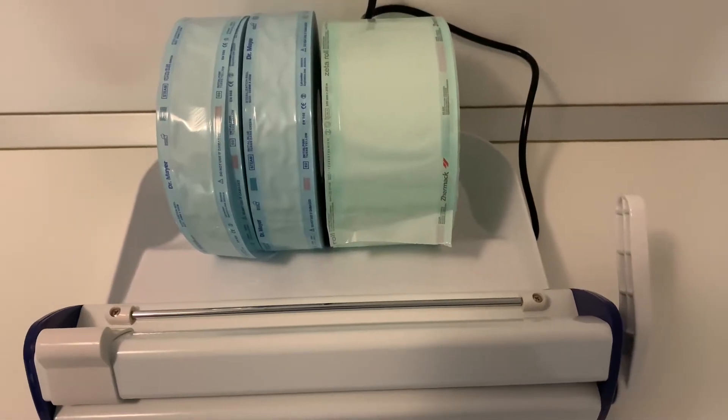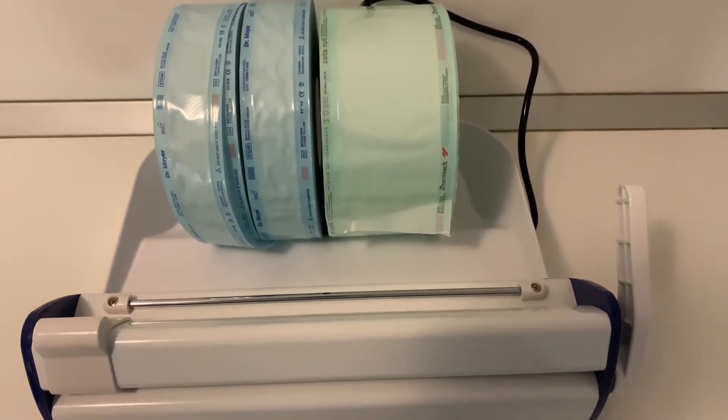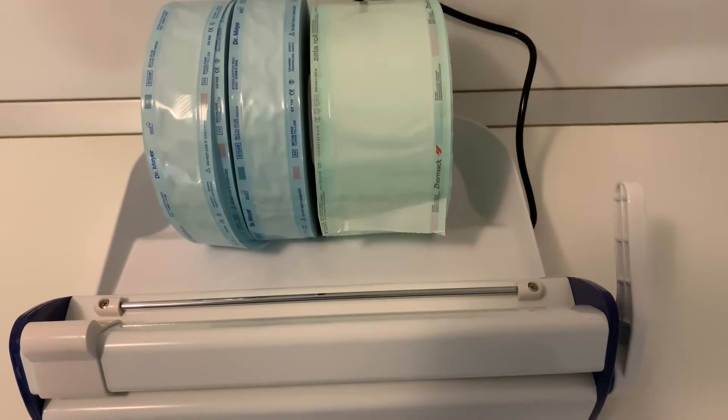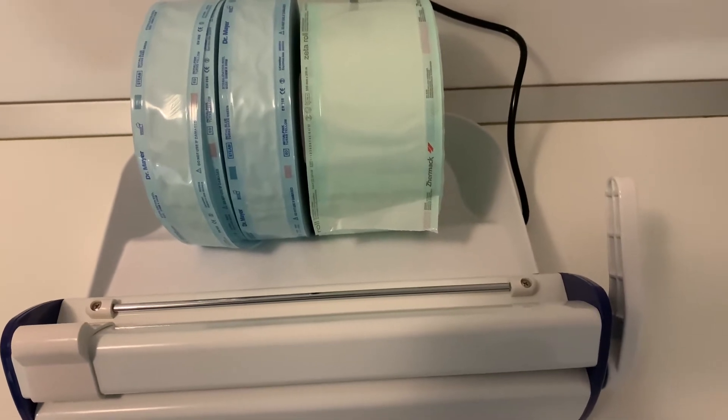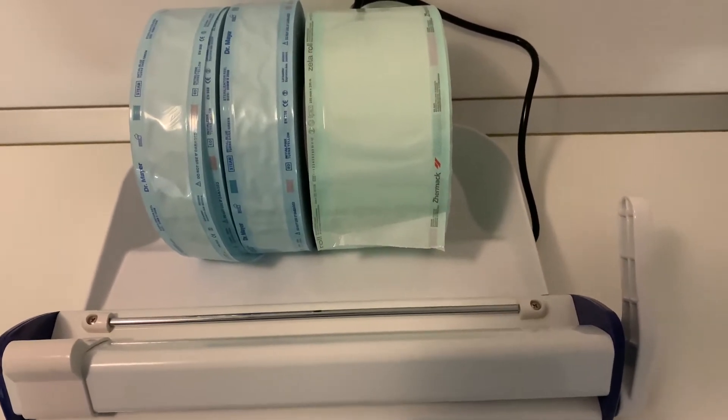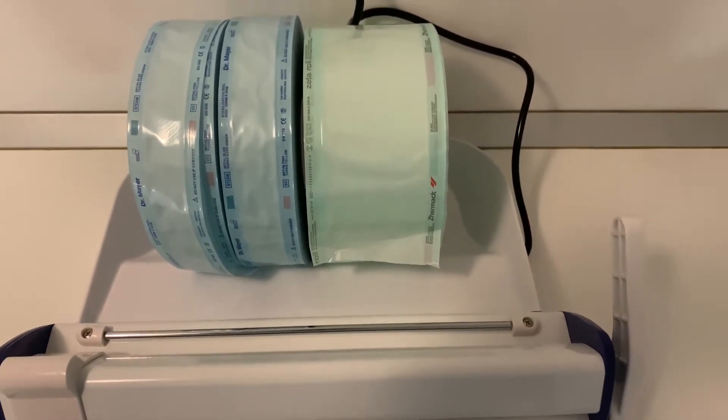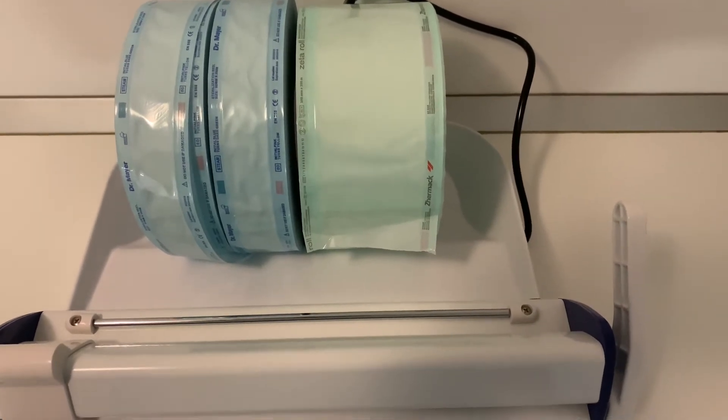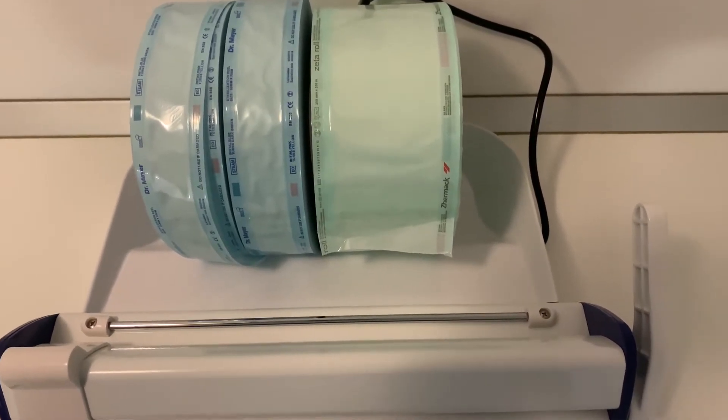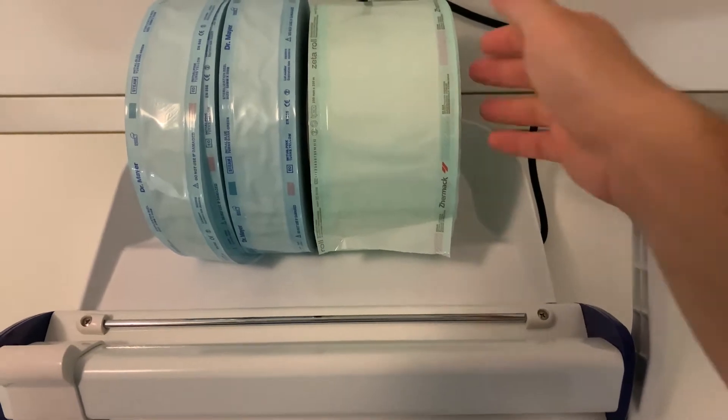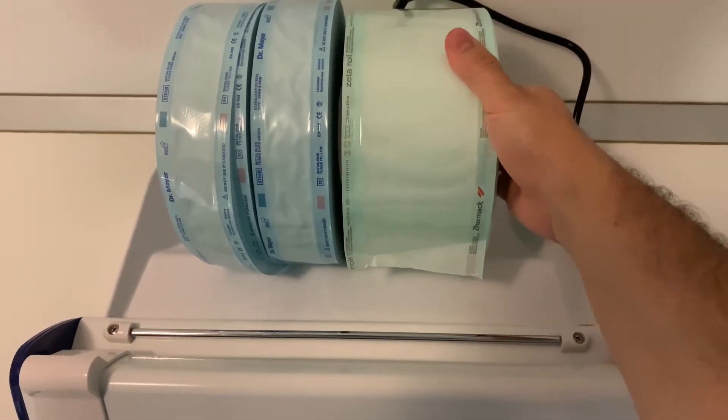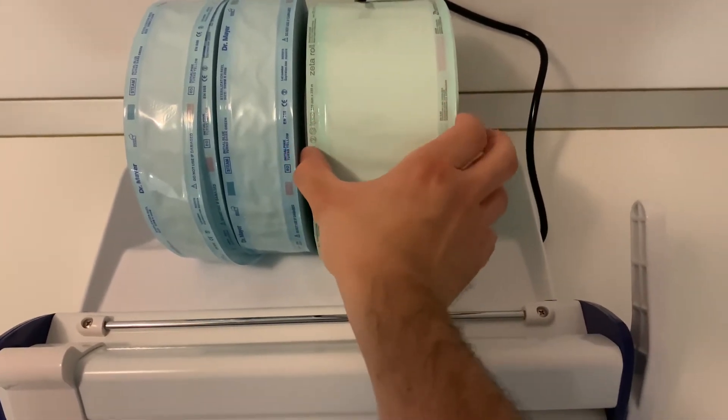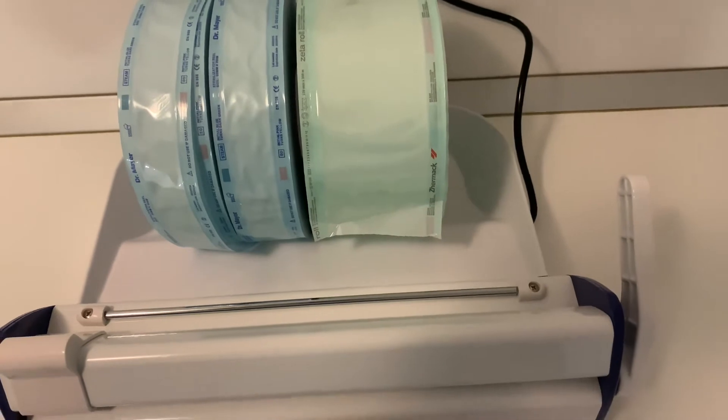This is a short presentation of the Cermak sterilization pouches in the form of a roll. They are called Zeta Roll. This is the 10 centimeter width version.